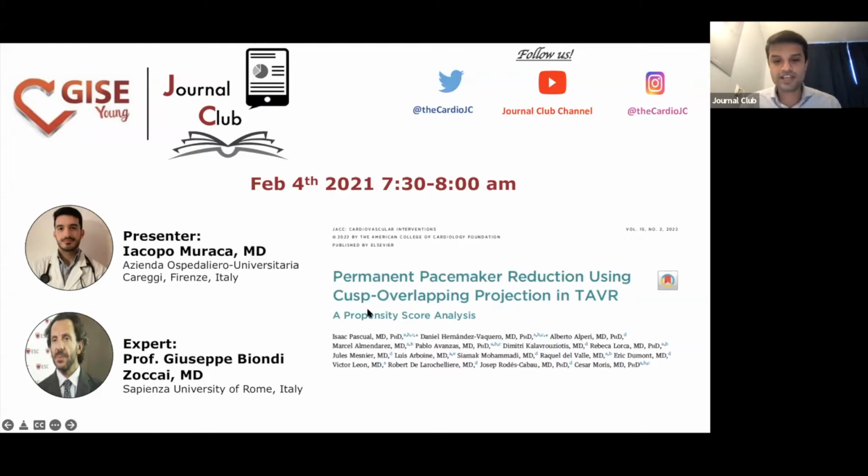The topic of discussion today is, let's say, quite the hot topic about cusp overlap, which you might have heard in many different contexts with regards to TAVR, but today we'll be focusing on the article which looks at cusp overlap for pacemaker implantation. We know that pacemaker implantation is an important issue as we move to low-risk TAVI, so we'll give a few more seconds to the poll, which says which of the following reduces pacemaker rates in TAVR, and most of you have answered higher implantations, which obviously leads to the question, how can we achieve higher implantations? And Iacopo, I'm looking forward to you telling us about this paper and a bit more about this field. So please take it away.